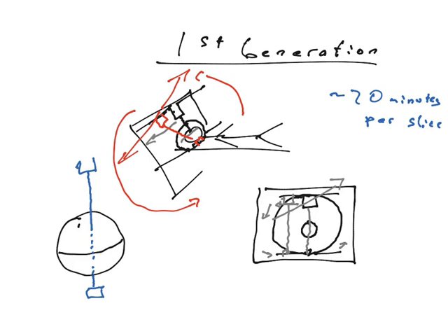Well, as this source slides left and right, you're basically allowing the X-rays to be absorbed by this kind of slice in the ball. And so you're going to create an image of a single thin slice of the brain or of the ball or whatever object it is you're imaging.